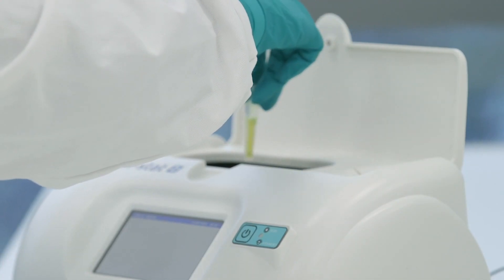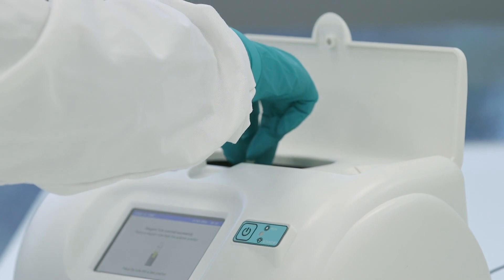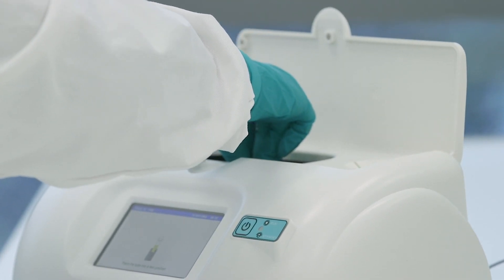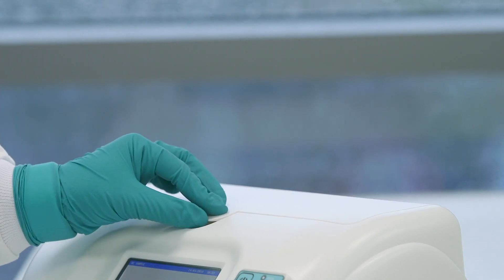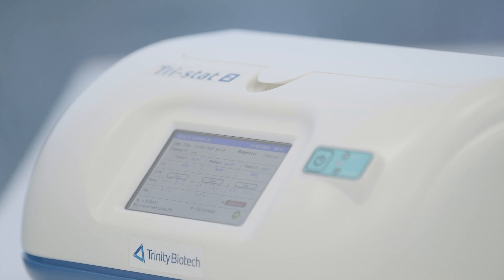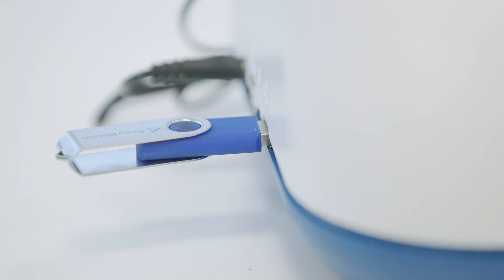It is important to scan and position all tubes within the three-minute time frame. Close the lid when all tubes are in position and the test will start automatically. Results will display in 10 minutes and will be stored in the analyzer or can be exported to a USB.